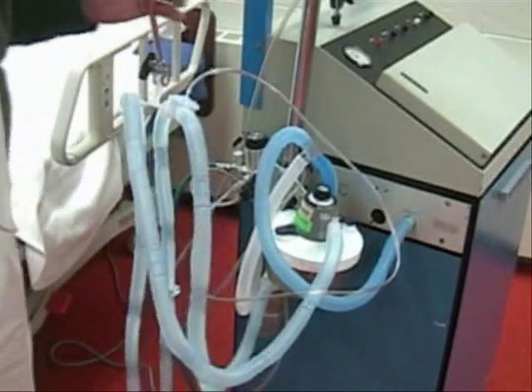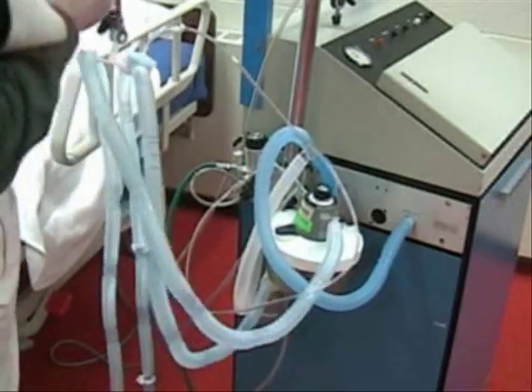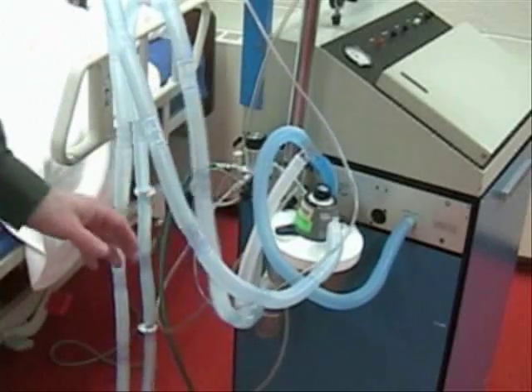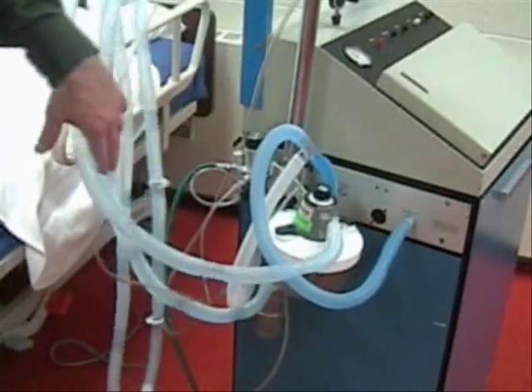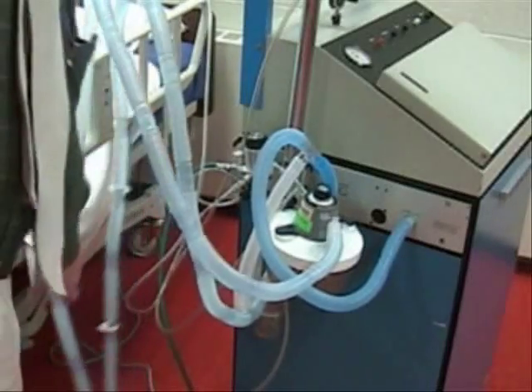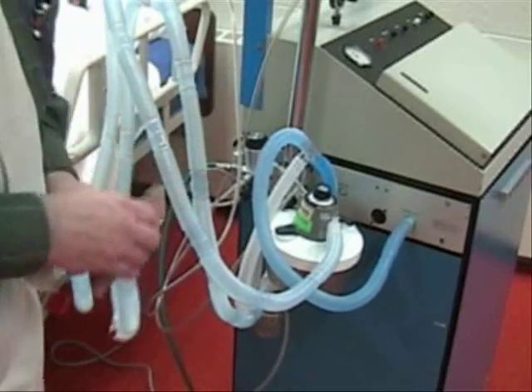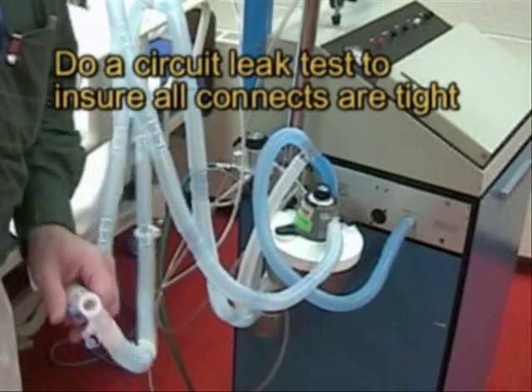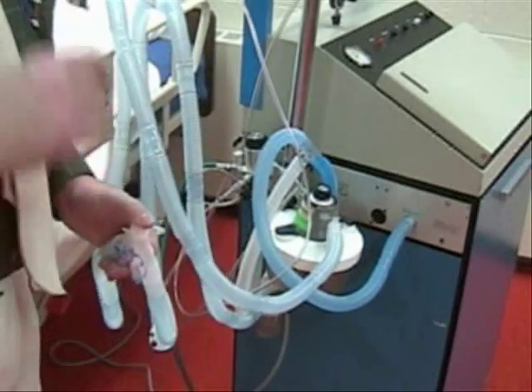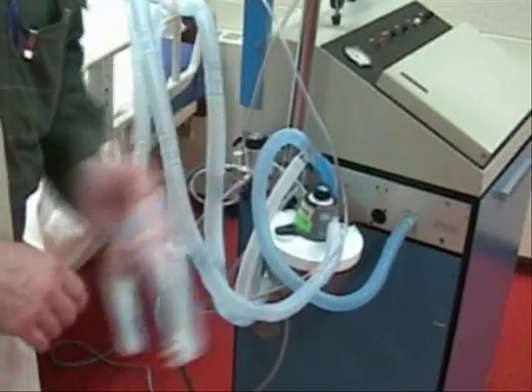Now we have all the tubing set up, and as you notice, this tubing is a lot more complicated than the ventilator tubing for the 900C, the 7200, or any of the other ventilators. That's because we have a lot more connections to make, so it's imperative when you use these ventilators that you know how they're connected and where everything goes. The last thing you do is a circuit leak test: set the ventilator at a low volume like 100 mLs, occlude this end, press the ventilator, and see how much pressure you can generate. If it doesn't leak out, you know you have a tight seal.